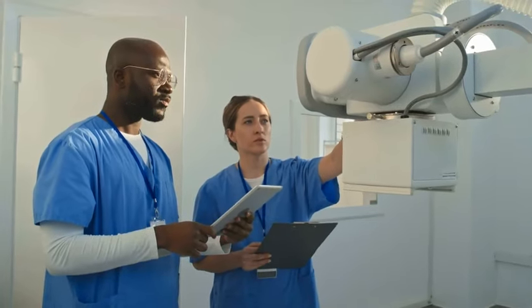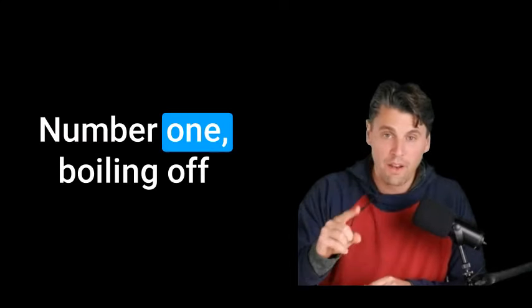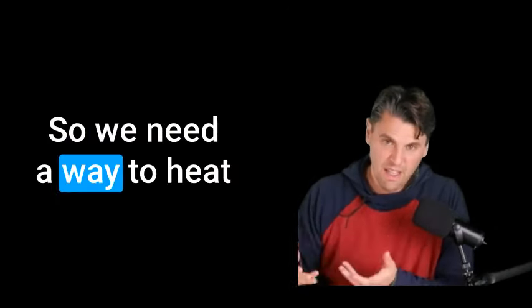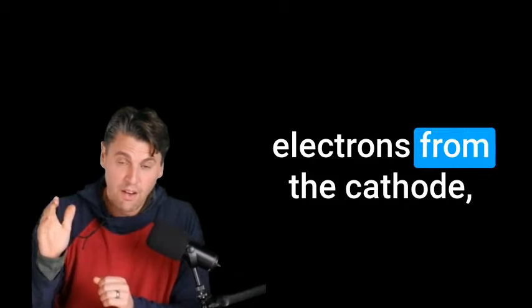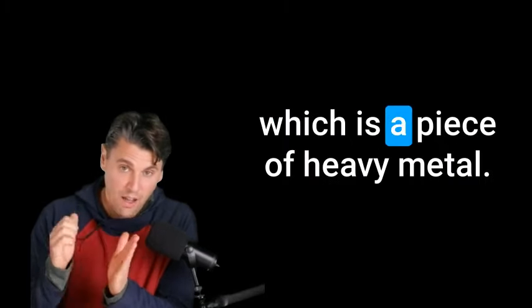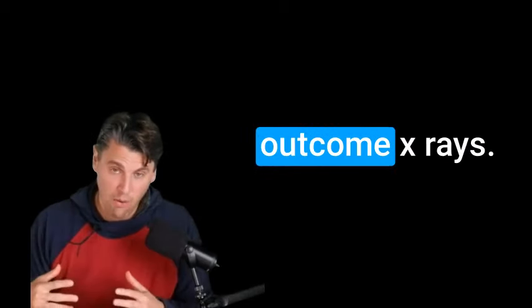First off, we know our X-ray tube works by doing two things, right? Number one, boiling off electrons from a filament. So we need a way to heat a filament up. Number two, providing a potential such that we pull those electrons from the cathode where they're made over to the anode, which is a piece of heavy metal. So those electrons hit that heavy metal and then out come X-rays.